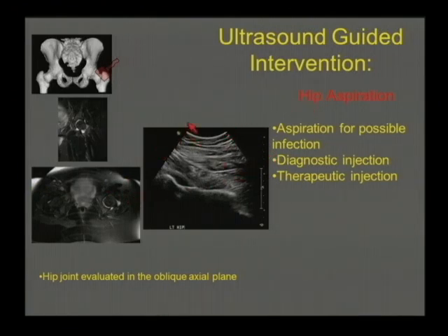So this is a longitudinal image, like we saw earlier, with the femoral head and neck regions demonstrated. You can see the anterior echogenic portion of the capsule, and that's bowed out and convex, and that's abnormal. Typically that's flat or even a little bit concave, so this corresponds well to the effusion that we could see with MR. In addition, there's an anechoic fluid collection visible in the anterior recess.